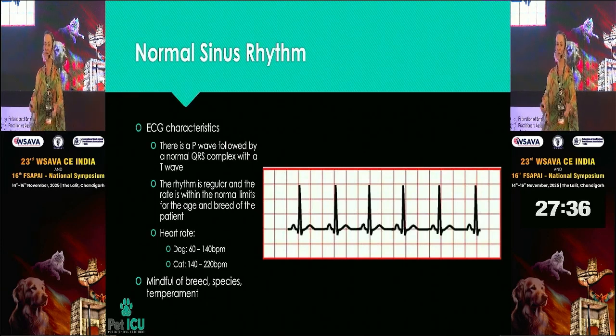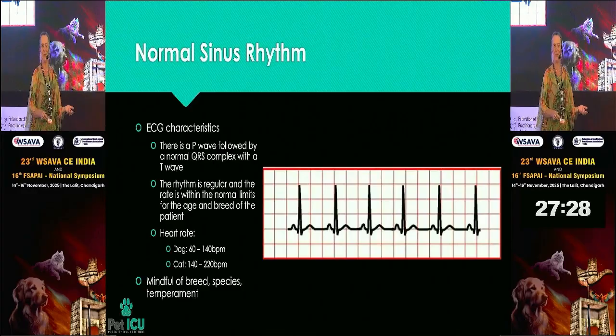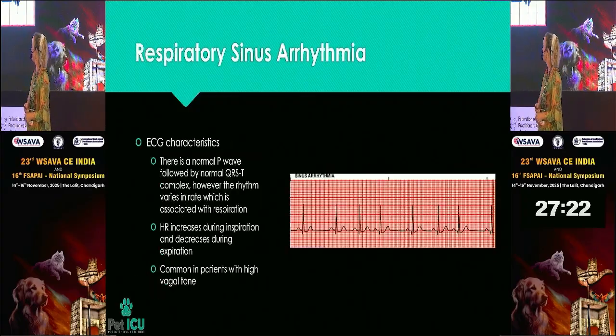And sometimes when you first hook up the ECG, it'll be through the roof. Let them calm down. And we've seen when we're running them constantly, they get up and have a drink or eat something, and their heart rate can spike over 200, and then they sit down and it drops as quick as it increases.